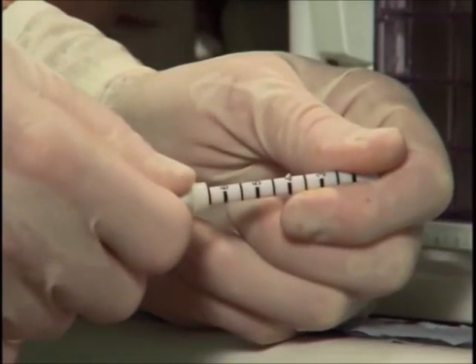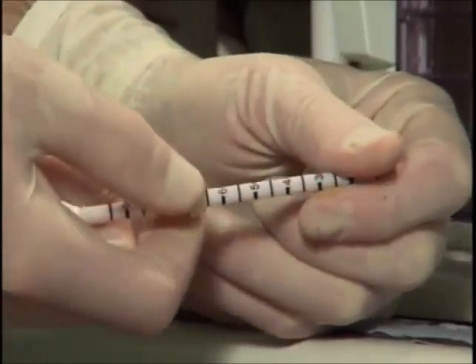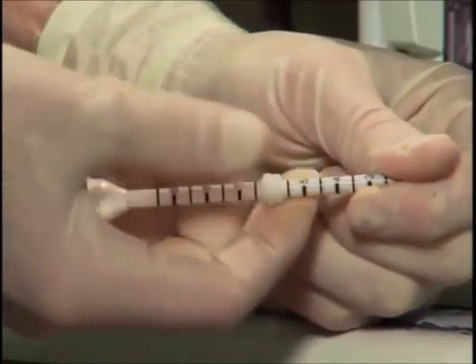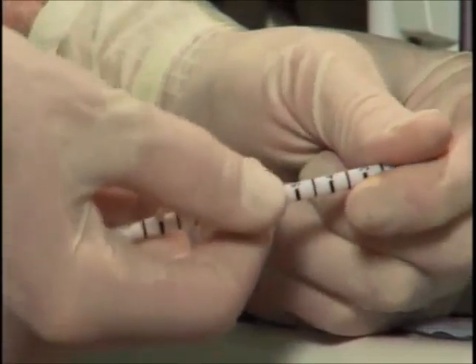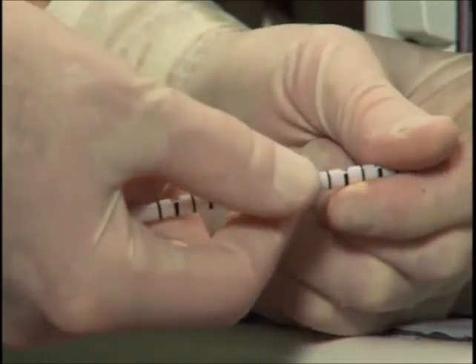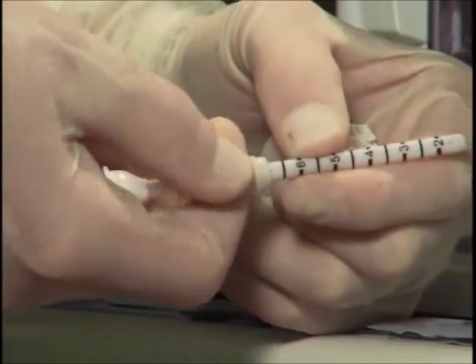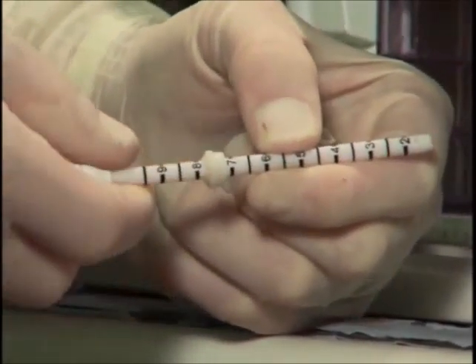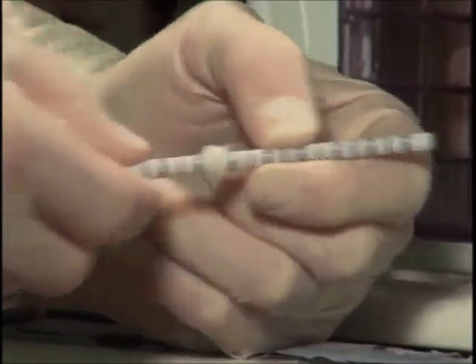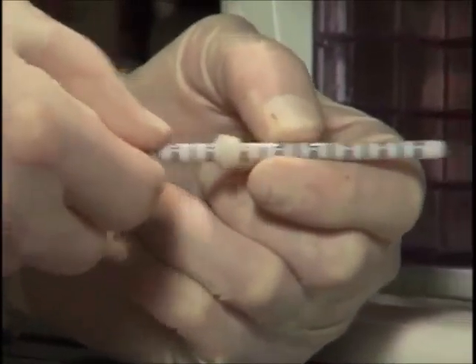Once you're satisfied with your localization planning and you know exactly where you'd like to place your trocar for biopsy, the first step is to set the depth mark. There's a ring that slides on the sheath that you can use to determine your depth. We have found it beneficial to give yourself another centimeter or so of leeway — so if you wanted to get to six centimeters, pull it back to about seven. As you're introducing the stylet and trocar, there's sometimes some degree of recoil in the breast tissue and you may actually need to indent the breast somewhat to get to your ultimate depth.